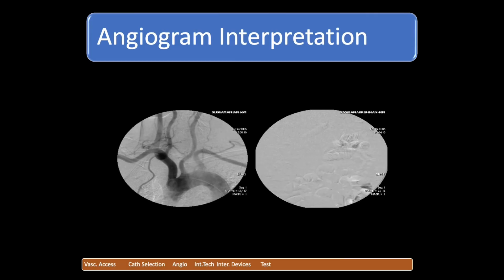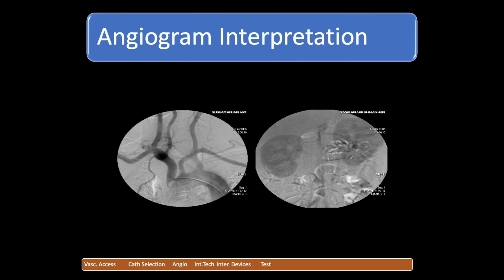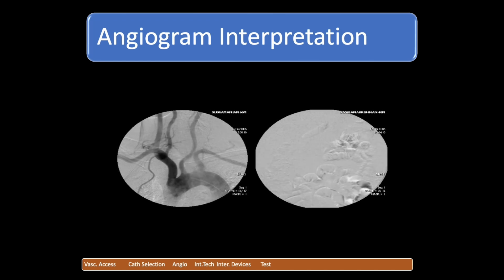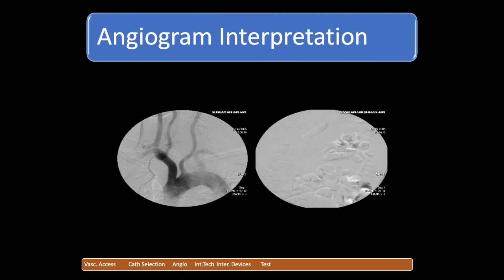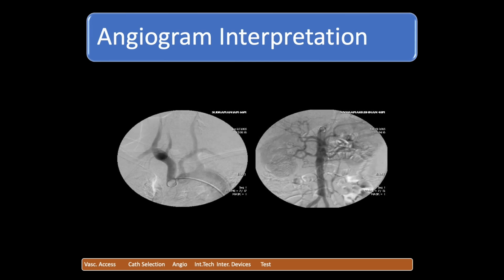Okay. Then angiogram interpretation, I told you, starts from the catheter. The catheter is placed from the femoral, descending aorta, not coming from the axillary or anything, most probably from the femoral only, and then placed in the ascending aorta. That is the catheter position. Then you have to say what you see in the arterial phase. What do you see here? You see the brachiocephalic trunk, left common carotid and left subclavian, and then subsequent branches of that one. So this is the fresh angiogram.